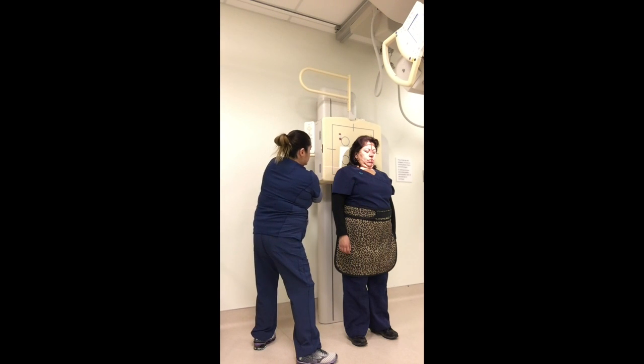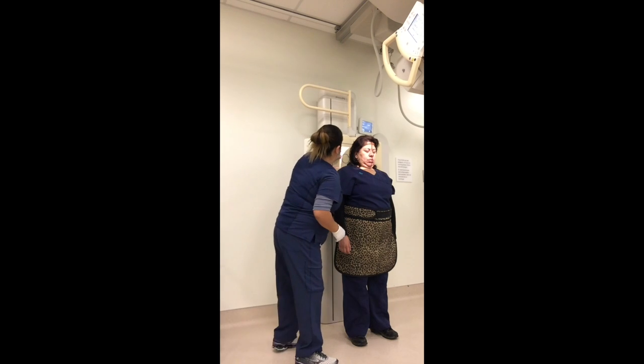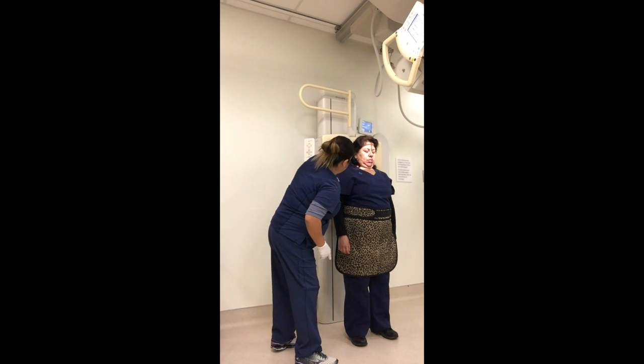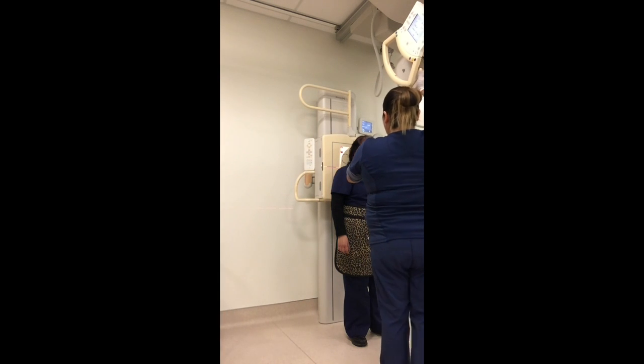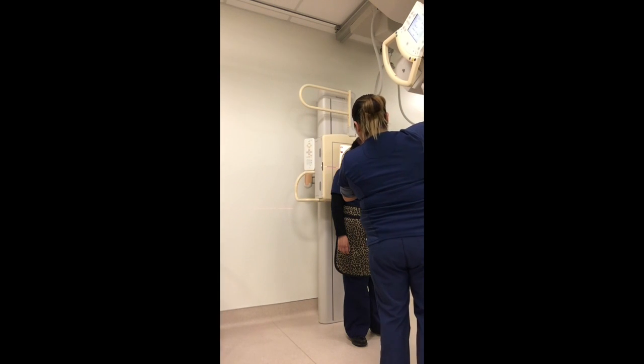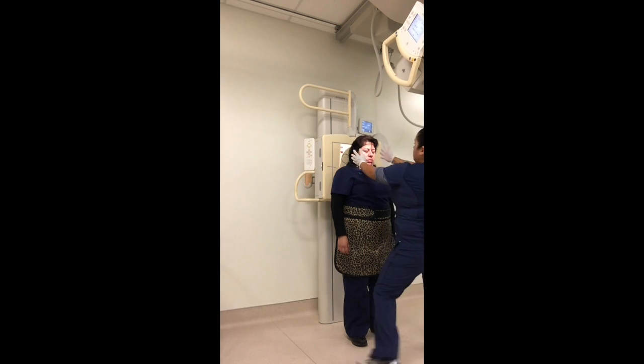This is going to move down. My right marker is on my patient's right side. My patient is shielded. And I'm going to open my collimation just a little to make sure I get the entire top of her head.